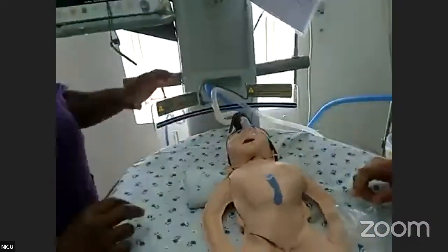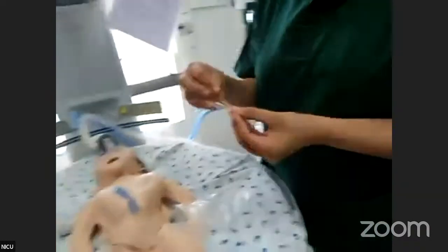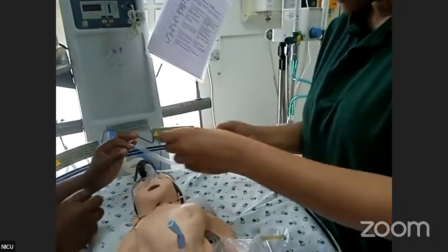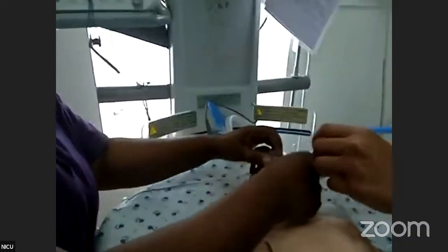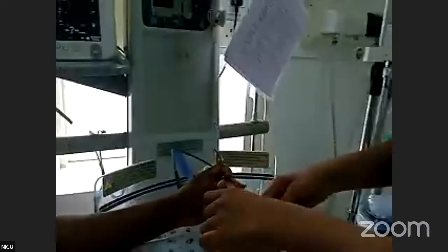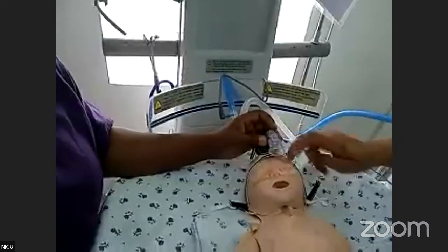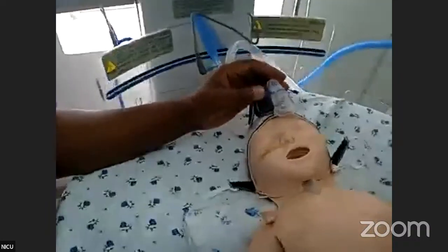And in order to prevent skin injury, it is important to use a skin-friendly plaster such as Duoderm, as you can see here. This can be left on the baby's skin in the mustache area below the baby's nose. So this can be left here in the mustache area, covering the philtrum. And likewise, while you're using the mask, you can leave it on the triangular area on both sides of the baby's nose.